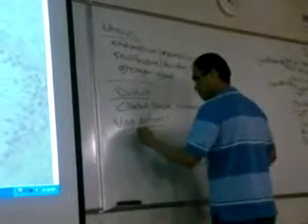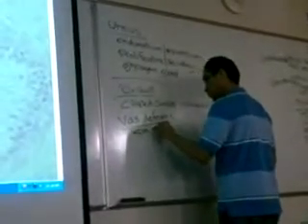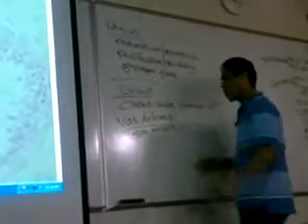So let's say pseudostratified columnar epithelial tissue with stereocilia, not regular cilia, stereocilia. It's like the improved version of cilia. So be able to identify the smooth muscle. That's important with the function of the tube. It's got to push the sperm along.